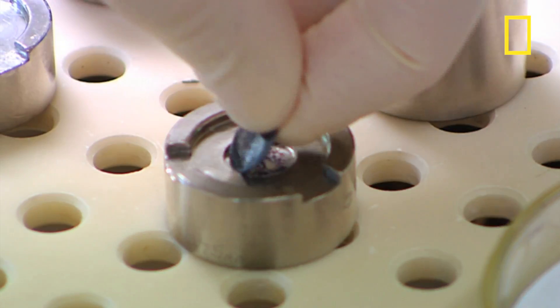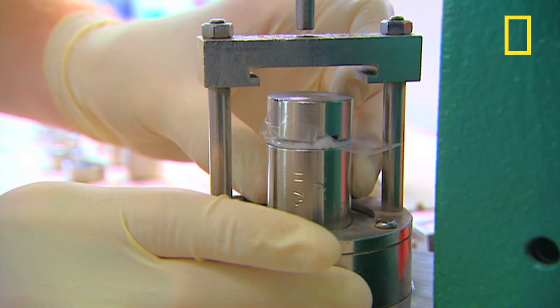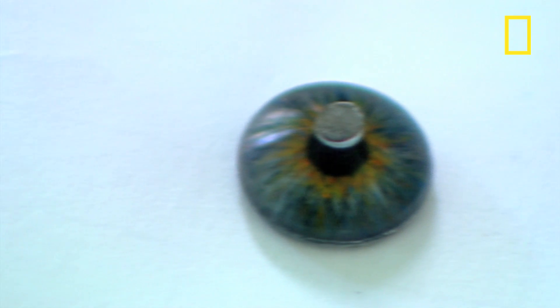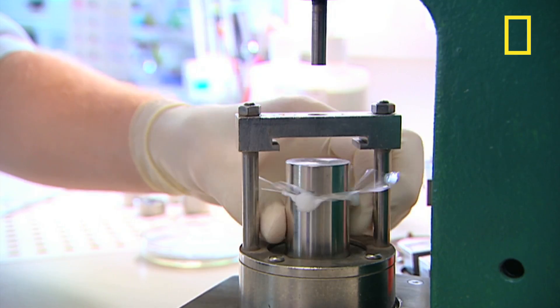After 18 hours the iris paint is dry and it gets pressed into a button-shaped disc. This puts a curve on top of the iris so that it will be flush on top of the round eye.